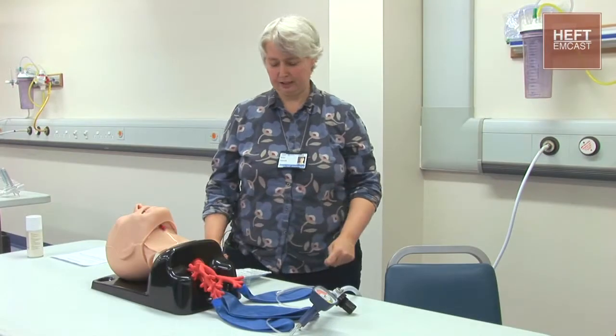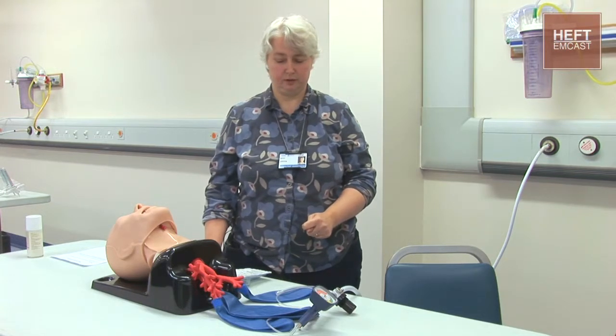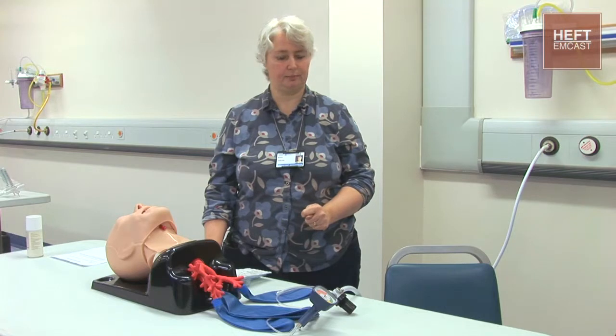I'm going to demonstrate use of the cricothyroid catheter and ManuJet, which would be used in a situation of a can't intubate, can't ventilate situation, i.e., a plan D in the failed intubation scenarios.